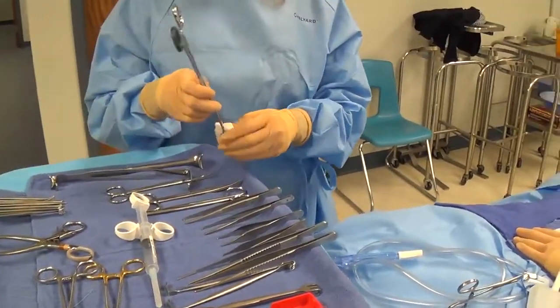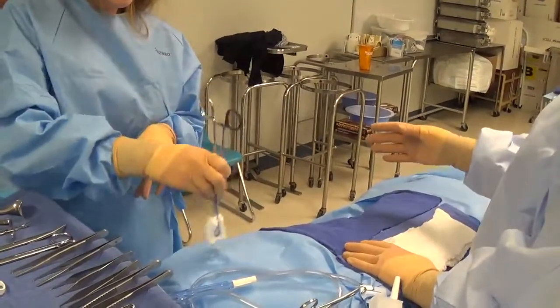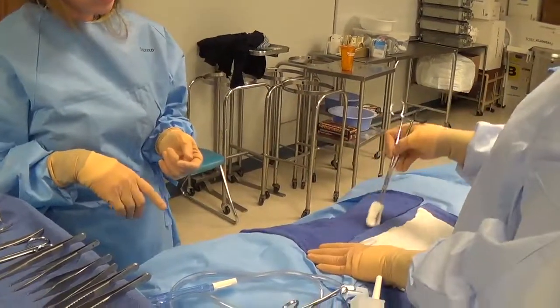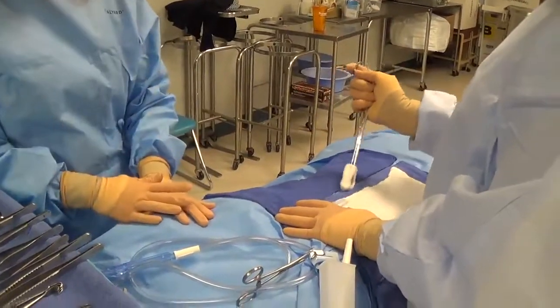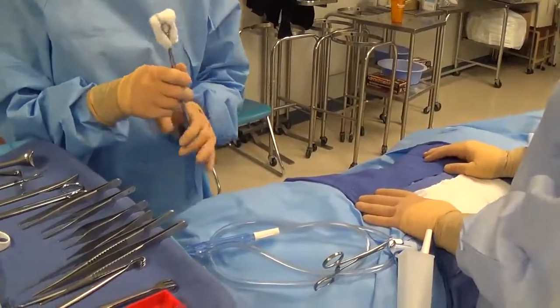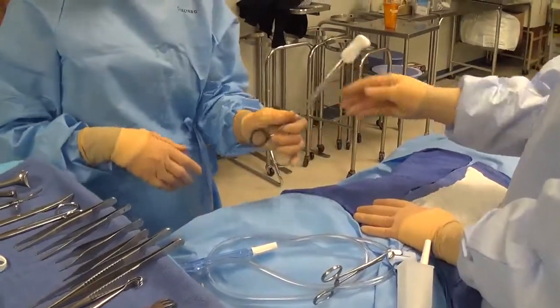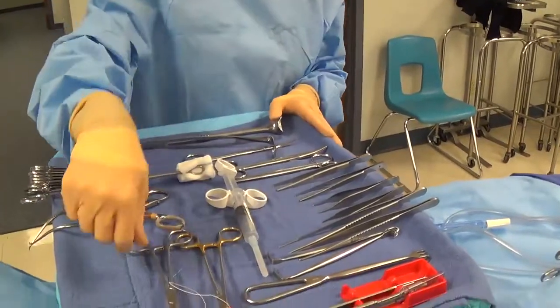For a sponge stick used in an abdominal cavity, think about how the surgeon is going to use it — they'll dissect with it inside the wound. Hand it to function, ready to use into the abdominal cavity. If working in a vaginal canal, you would hand it differently because the surgeon grabs it and inserts it upward. Think about how the instrument is going to function — that dictates how you need to hand it up to the field.